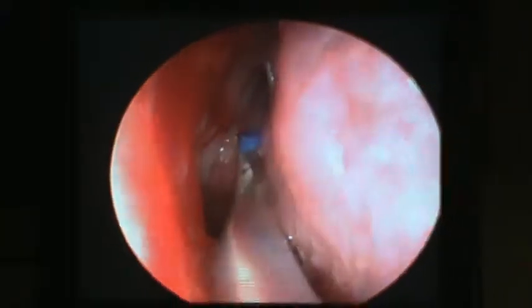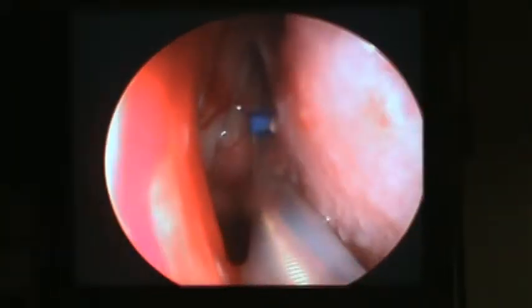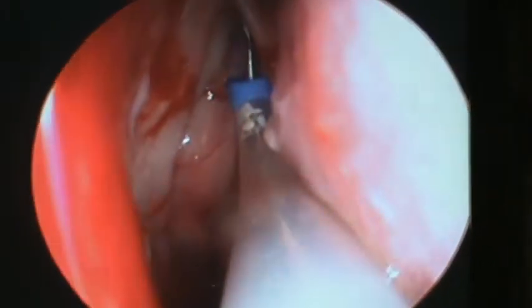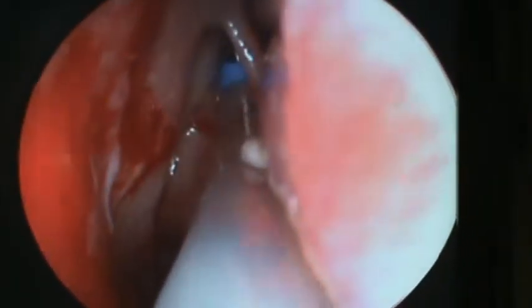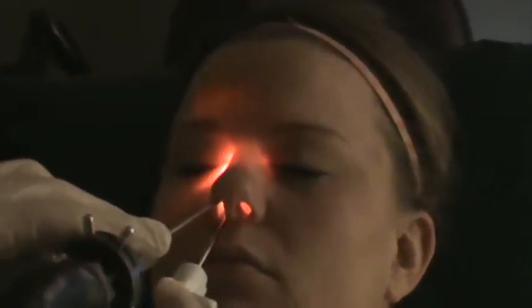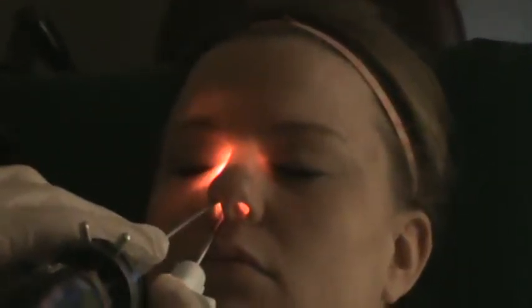On that side we'll move over to the other side. Very good. You're doing great. Okay, we're up in position already. We're going to advance to the right eye — a little pressure on the right side. There we go. A little bit of pressure, here we go.